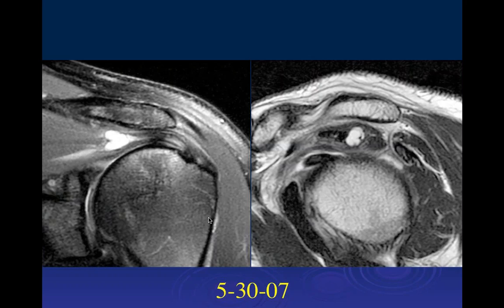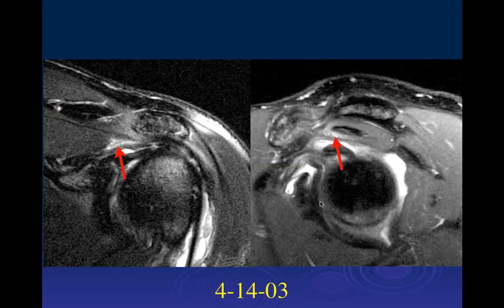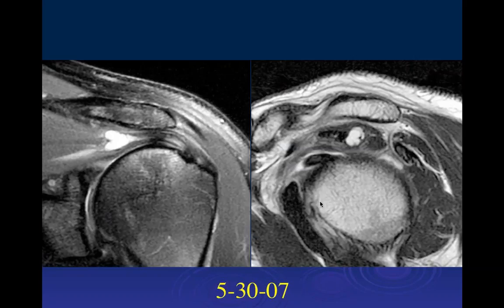The patient came back 4 years later, and this is what it looks like. Okay, so now we have a lobulated area of fluid within the myotendinous junction. So this is way past the arthrogram, so it's likely a propagation of fluid from a tear more distally. Yeah, so this is not an arthrogram here. This is just a heart-shaped intramuscular tear and a linear intratendinous tear, which we can see here kind of nicely. So this was really an intratendinous tear. That early stage we saw before was an early intramuscular component of it, and over time that just enlarged and became larger.